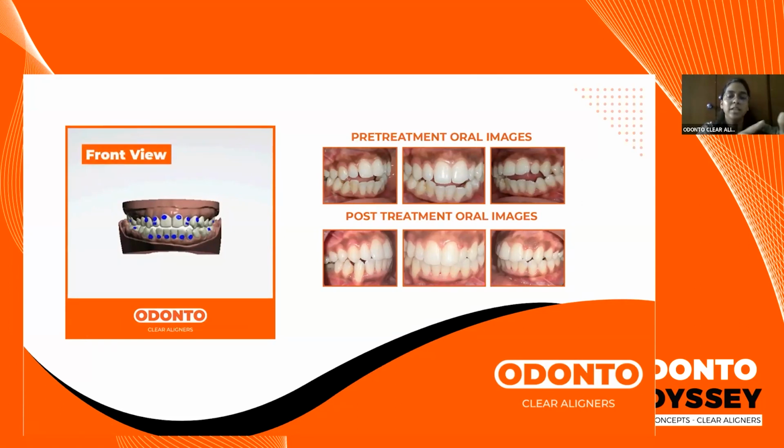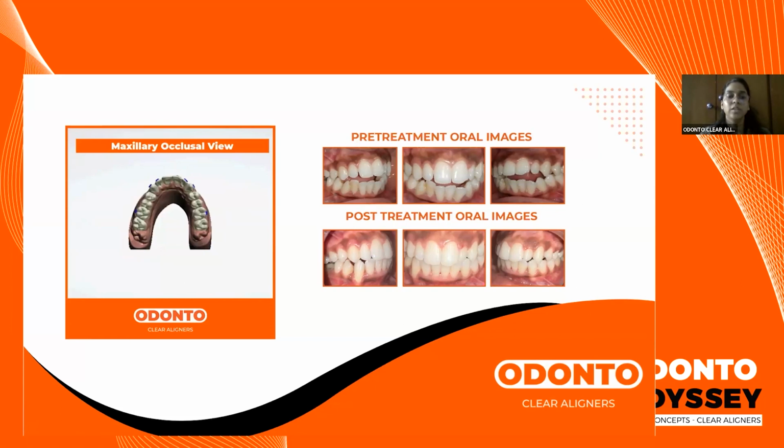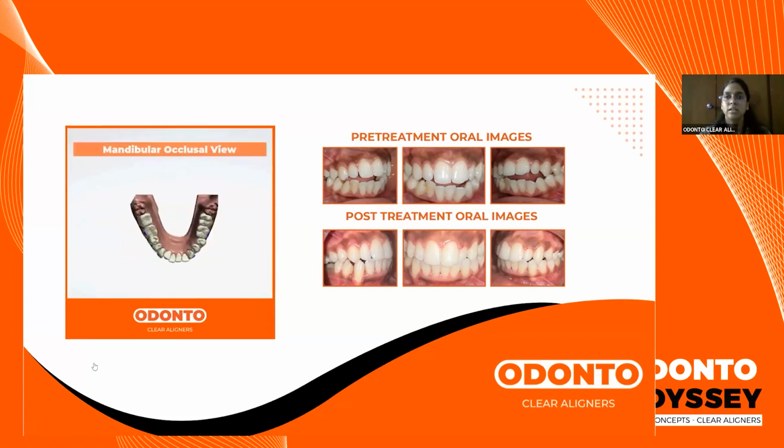There will be a slight amount of expansion and we bring about closing of the bite. If there are very large bites, beyond 3 millimeters or so, we will have to incorporate elastics, which the patient will have to wear in the anterior region. And in the posterior region, we will only have attachments. So even if the teeth at the back are not moving, you will notice that there are attachments which have been placed on the molars.